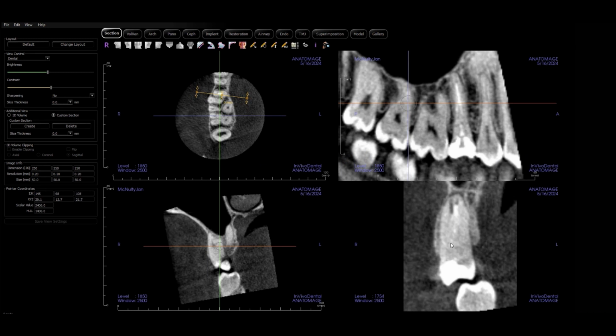Put your sealer in both. I would put a master apical gutta-percha point from the GuttaSmart system in one canal. I would place my size verifier in the other, make sure I can passively go to length. If so, take it out, use GuttaCore in that first one. I would then let it set, maybe 30 seconds. Reason being, you want that gutta-percha to cool so that when you pull this out, you don't get any pulling of the gutta-percha in this area.